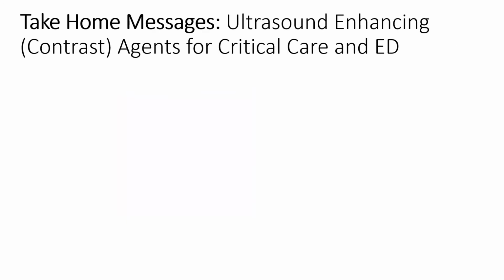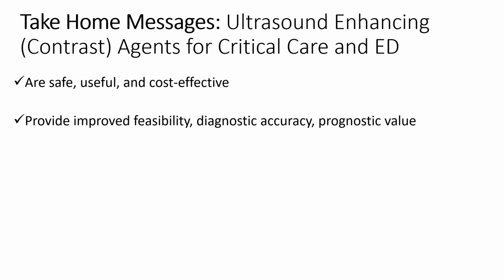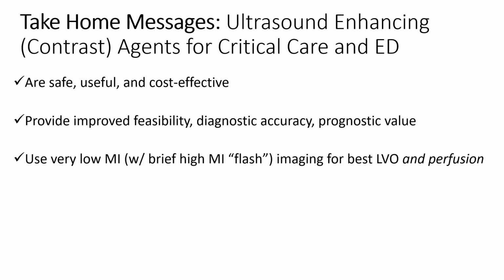So the take-home messages include the following, regarding ultrasound enhancing contrast agents for critical care and the emergency department. They are useful, safe, and cost effective. They provide improved feasibility, diagnostic accuracy, and prognostic value. They use very low MI with a brief high mechanical index flash. This type of imaging is best to be able to evaluate both left ventricular opacification and perfusion.